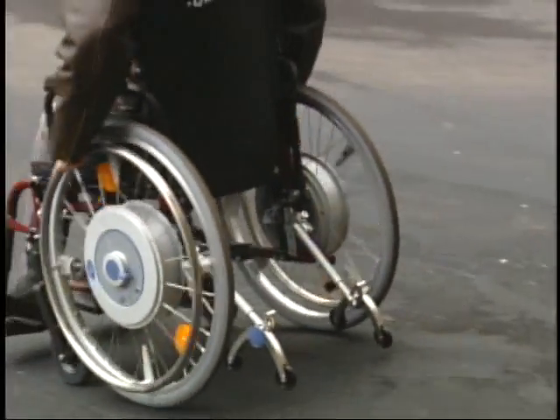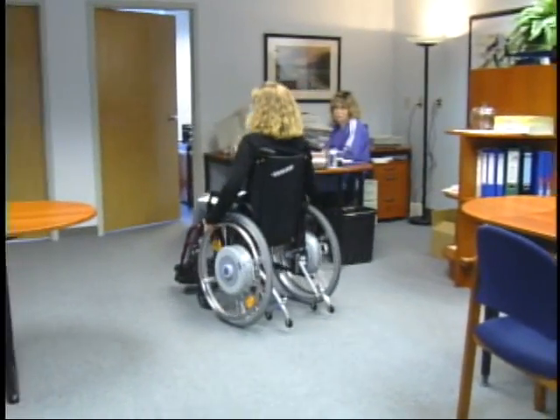The push rim activation of Emotion lets you navigate with ease and reduces fatigue. The three different power levels and the ability to fine-tune each wheel makes Emotion an option for almost anyone.